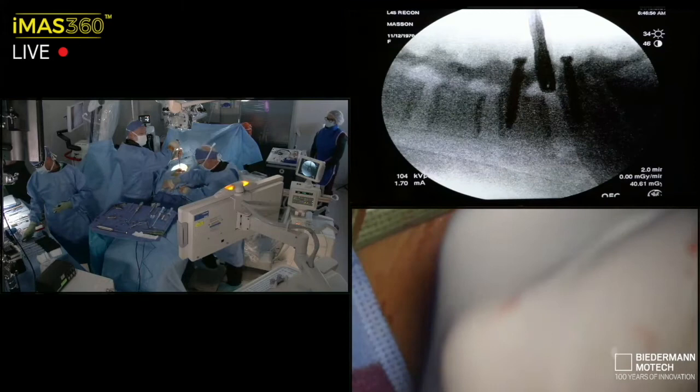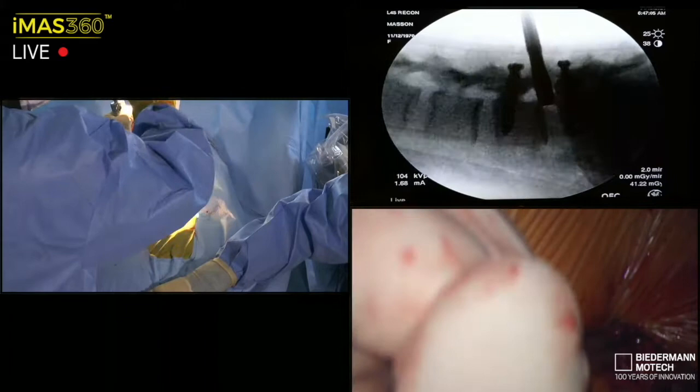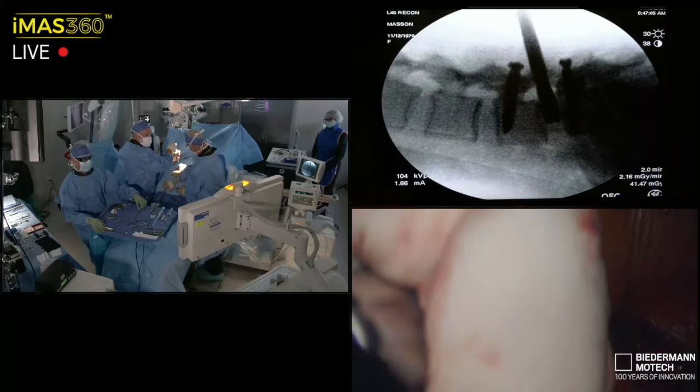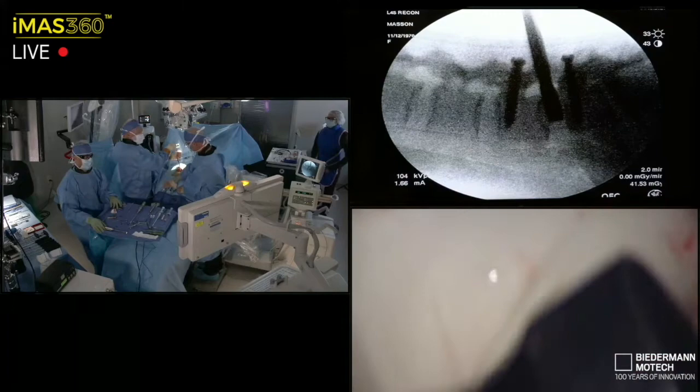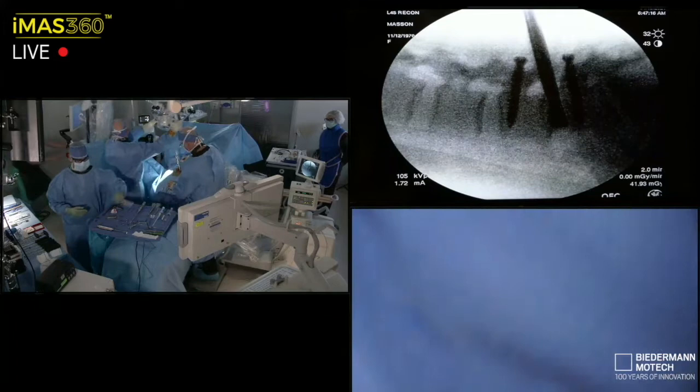All right, so we take this tapered tip, steerable template. We gently deliver it down to our hole, our breach in the posterior disc space. Still quiet there, quiet. Let's go ahead here and assess this now. Okay, let's see where we are. Let's see how we are relative to midline.